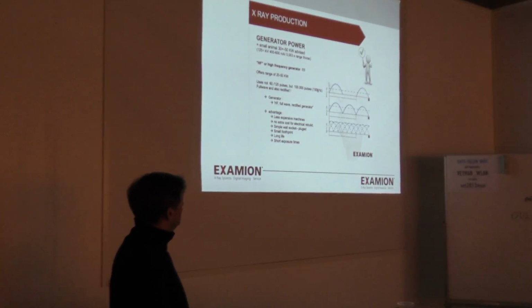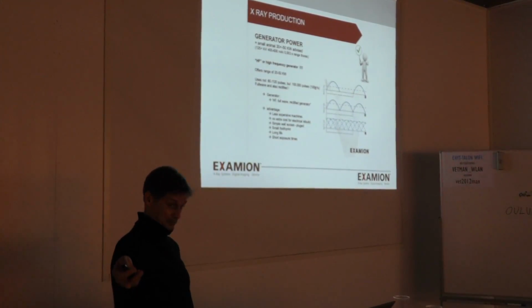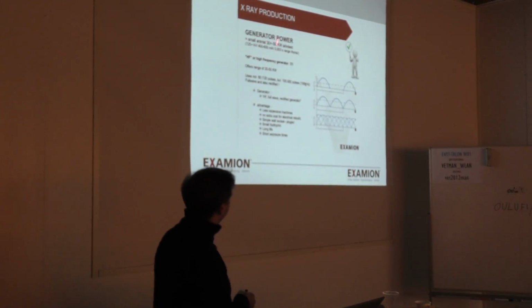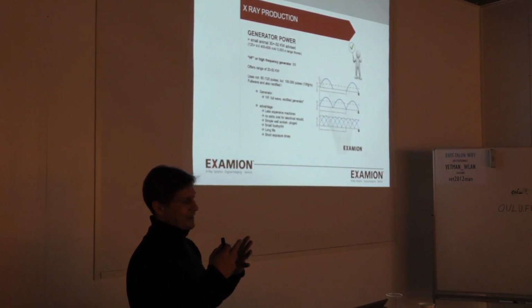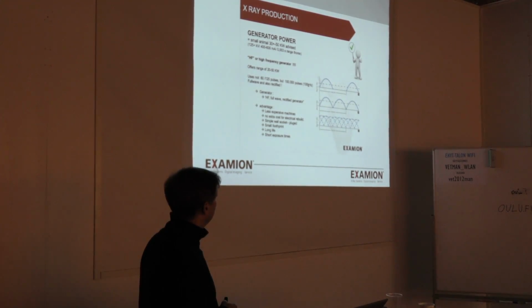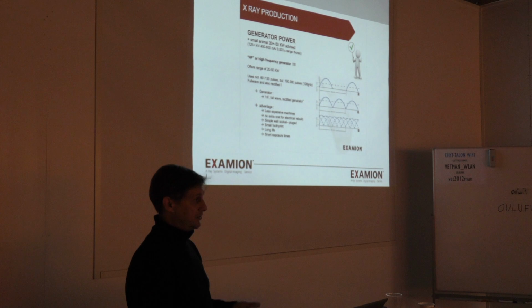It is first of all very important because the technology means now that the machine can be wall plugged. That means you have 220 volt, you put the plug of the X-ray machine in the wall, start X-raying, and you will also have the high power, which was previously not possible. So it opened up, especially for the veterinary field, and also for other fields like mobile clinics, quite a lot of options and allowed us to do mobile applications, even in airplanes, even in trucks, it's all possible. That has been quite a relief.